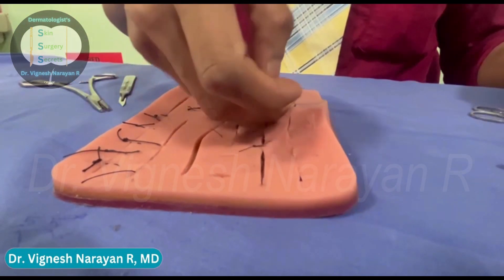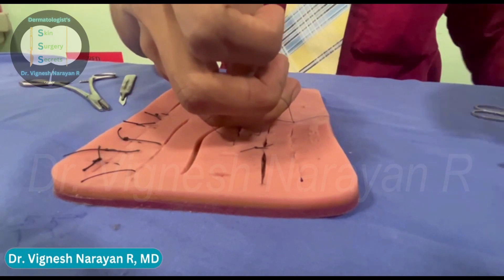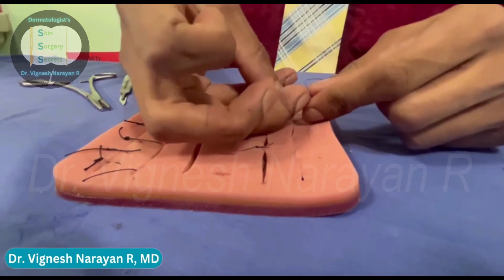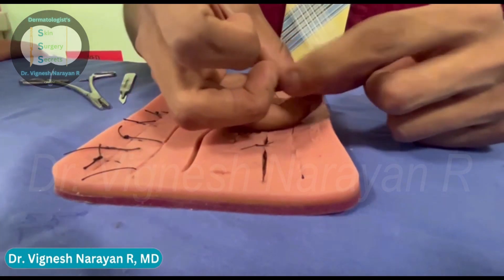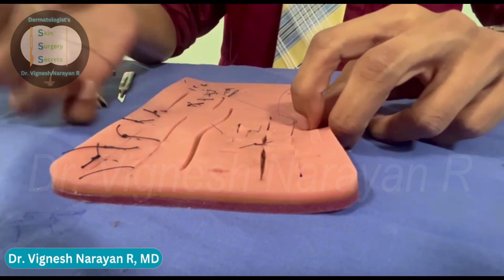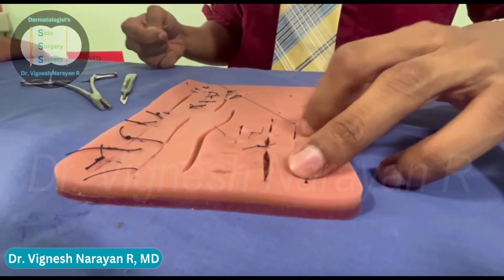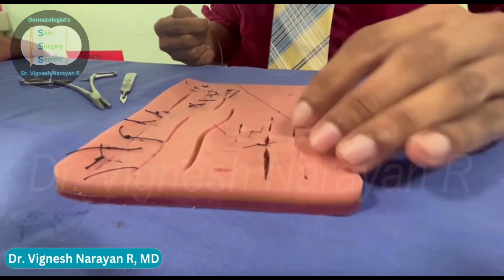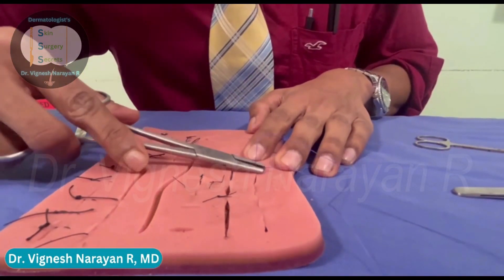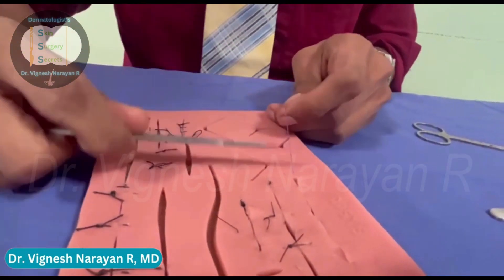I'm still going to maintain this loop because in the last step you're going to pass the needle end of the thread through. Here you can see I'm taking the needle end and passing it through the loop of the Aberdeen knot. Once it has come out through the loop, you can let go of the loop and pull the needle end through. This completes your Aberdeen knot and you can see the wound is approximated. Now I want to bury the suture since I'm using an absorbable suture material, so I'm passing from the dermal tissue and coming out through the epidermis. Then I cut the suture material close.